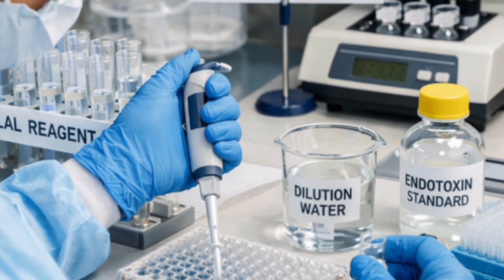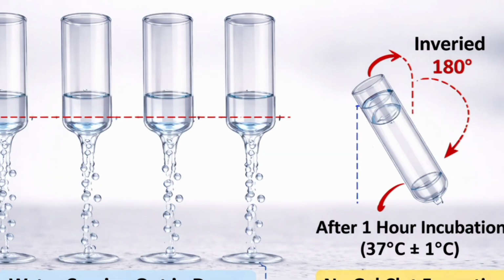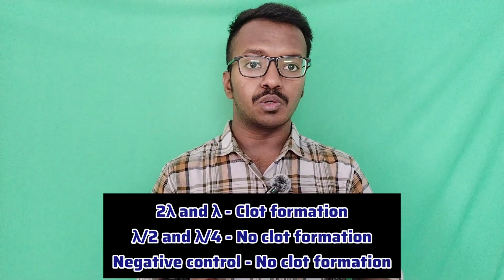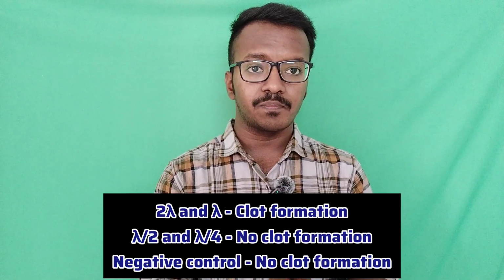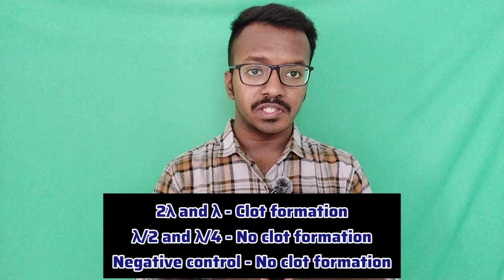The labeled lysate sensitivity test is considered as complying when the lowest concentrations of standard solution, lambda by 2 and lambda by 4, show a negative result. I mean no gel clot formation in all replicates. So the final result: 2 lambda and lambda form a gel clot, and lambda by 2, lambda by 4 and the negative control should not form a gel clot. Then only the test will comply. Here the lambda, the border of gel clot formation, 0.03125, is the endpoint concentration of lysate.